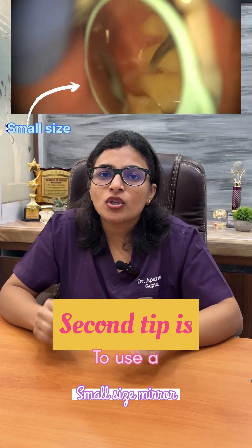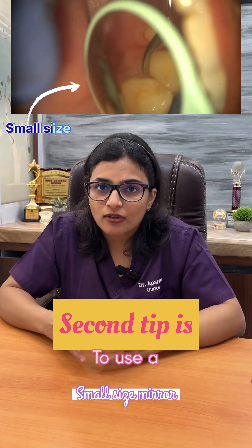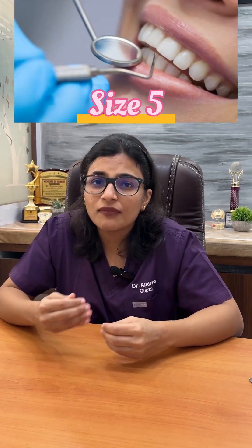The second tip is to use a small size mirror. We typically use standard mirrors, which are size 5, but you can use a size 4 or a size 3.